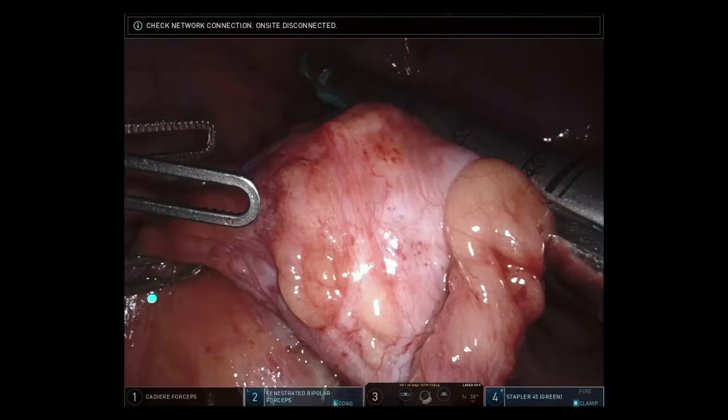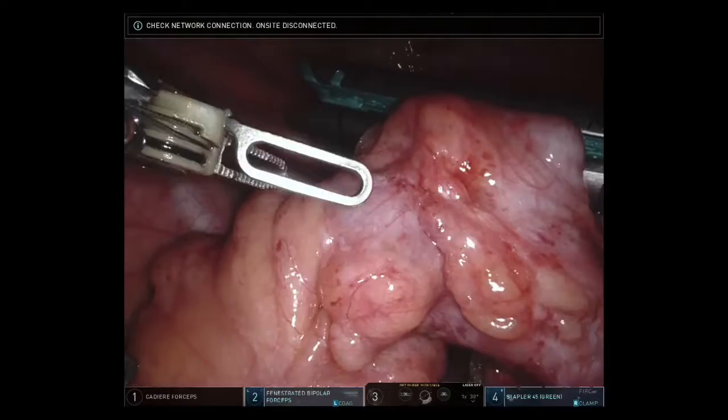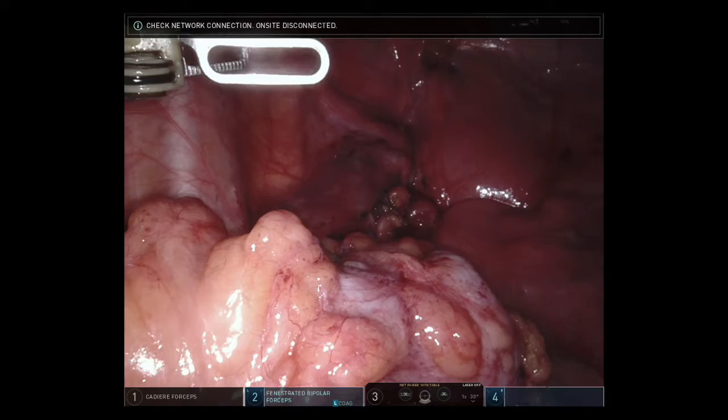We then turned our attention to transection of the sigmoid colon by using a green load of the robotic stapler. The specimen was then completely freed and we were able to move it down into the depths of the pelvis.